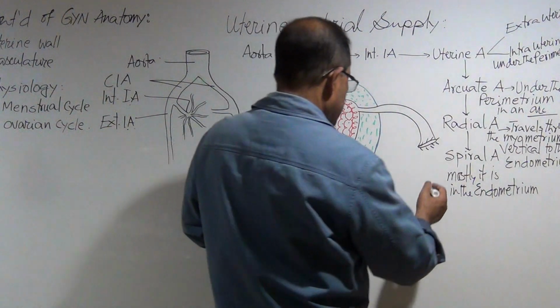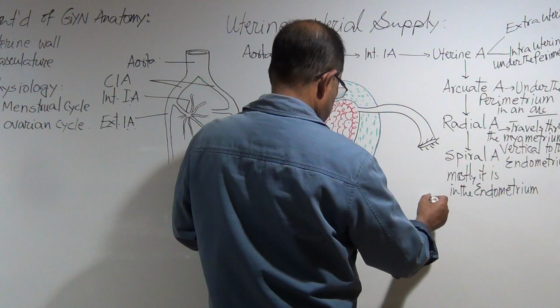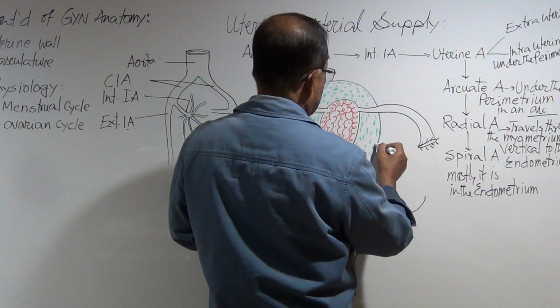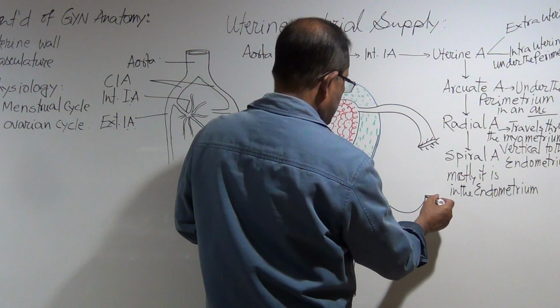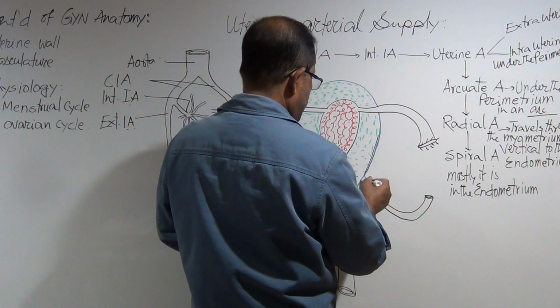I'm just showing that uterine artery. Okay, so this is uterine artery, the extrauterine part.